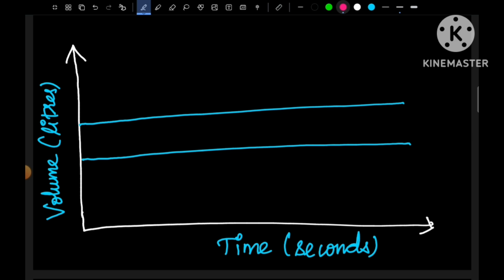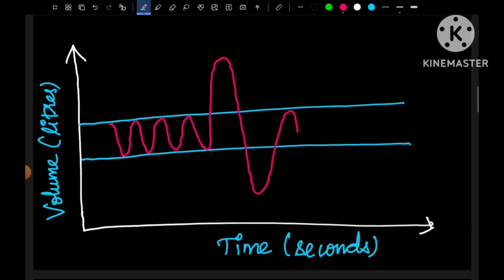So what is this reference line for? See, I just draw it. First you are drawing a loop in these reference lines. Then now try to draw a dotted line at this lowest point.